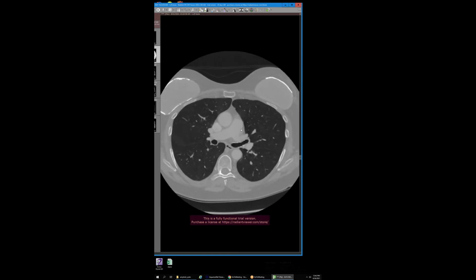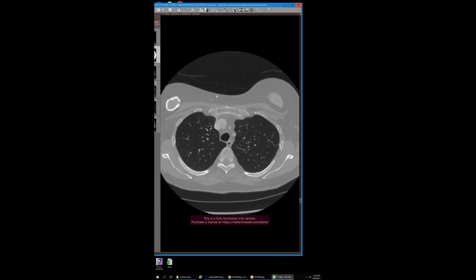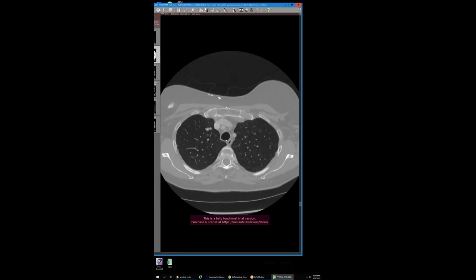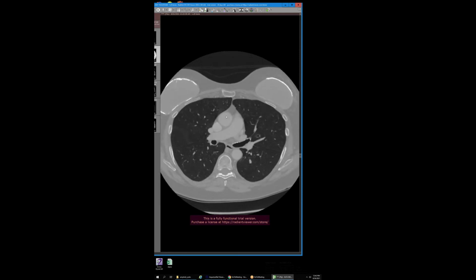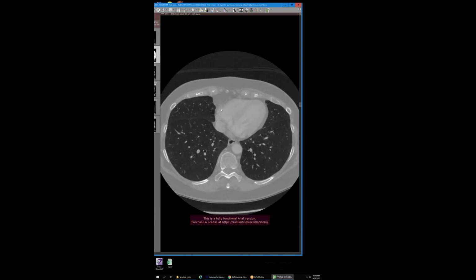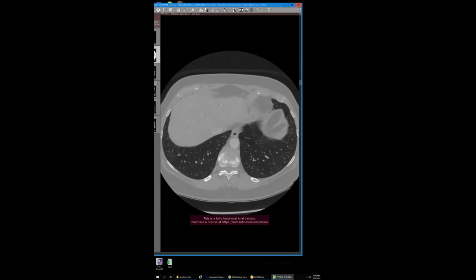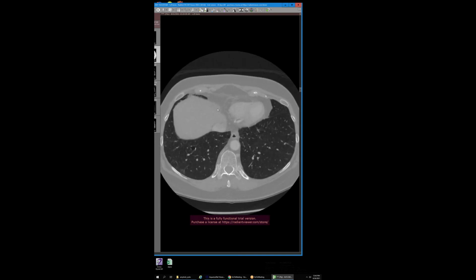Yeah. Okay. Yeah. Well, sometimes it's a little nodule in the wall of the cyst. It doesn't have to go all the way around it. Yeah. So most cases of amyloid, I think of, I have those either robust calcification or those big chunky calcified nodules, or just pure cystic disease. But okay.